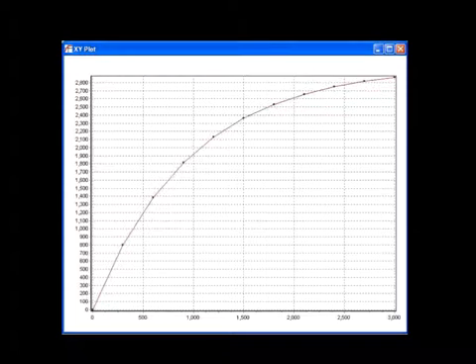Personally, I think you want to be at about 90%, because that's what you can do in 2 buildup constants. But it depends on a lot of factors, like what your exact prep is and how much time you have to polarize. There are diminishing returns, right?